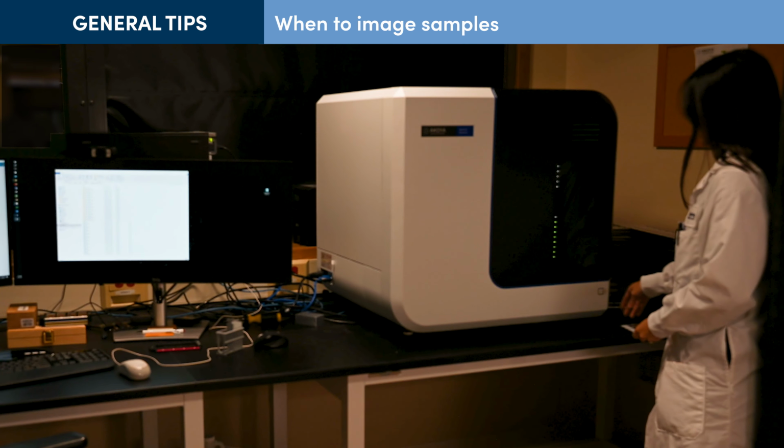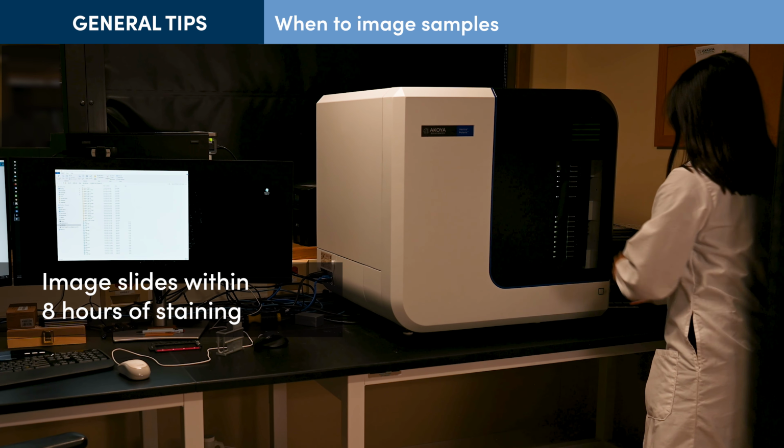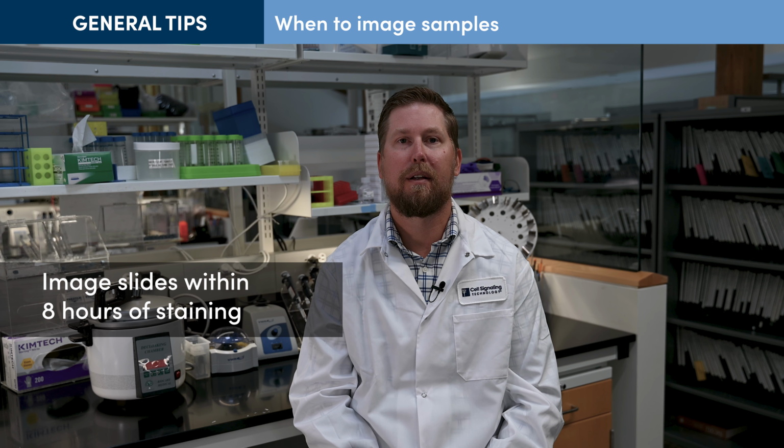Ideally, samples should be imaged by fluorescent microscopy within 8 hours or as soon as possible after completing each staining round. Long-term storage is not recommended. Now that we've covered general tips for success, please review specific guidance for manual SignalStar protocol in the next section of this video, or skip ahead for specific tips for automated staining.